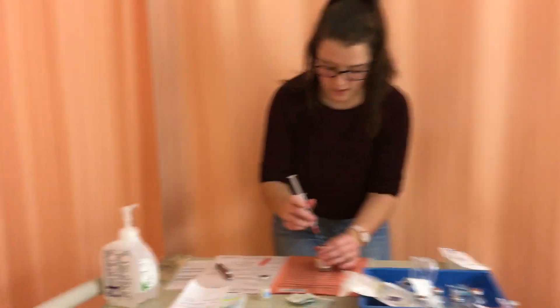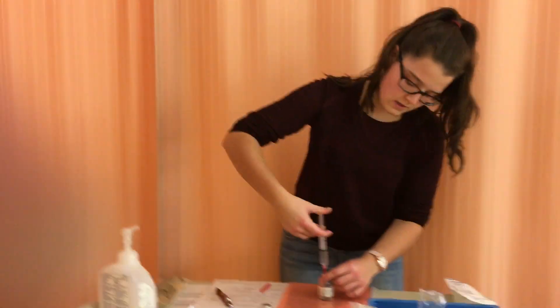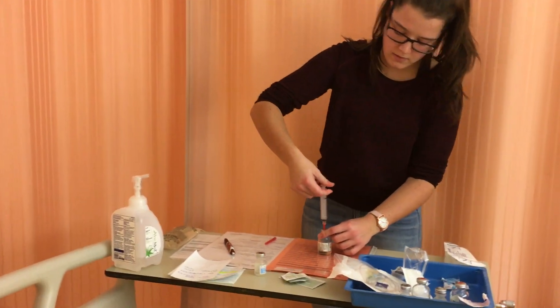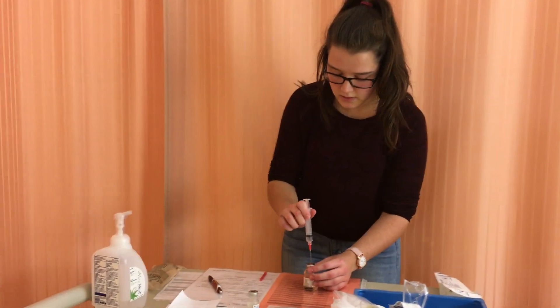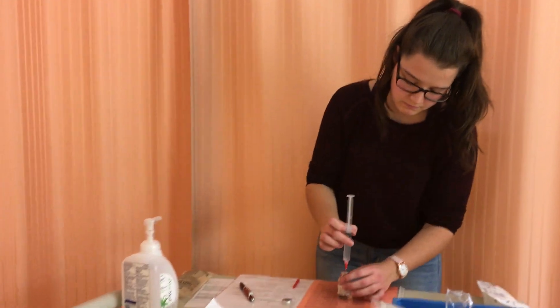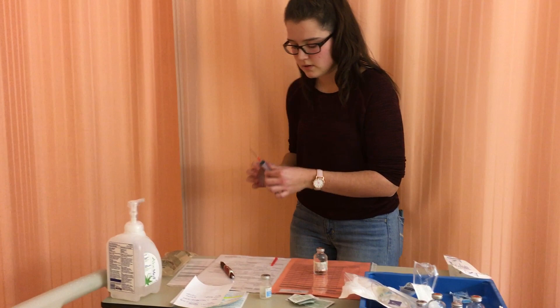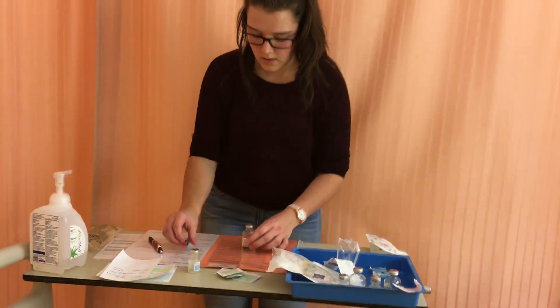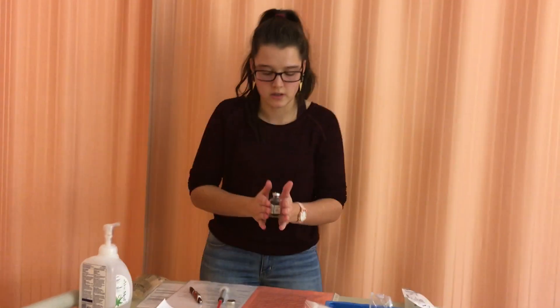I'm going to insert the sterile water into my medication vial, starting slowly. I'll take some air out as well to release the pressure. Now I can remove the syringe and cover my needle. I'll mix the medication — not too quickly because I don't want to create any bubbles, but until it's diluted and clear.